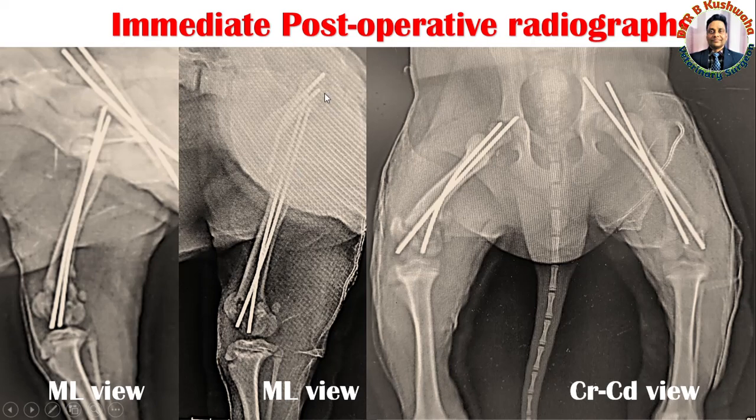These are the radiographs taken immediately after operation. This is the medial-lateral view of the right femur bone and the medial-lateral view of the left femur bone. Since the fracture is Salter-Harris type, it is difficult to appreciate clearly, but you can see the patella and the reduction is in anatomical position. You can see the two pins crossing, and you can also see the crossing of the pins in the contralateral limb.